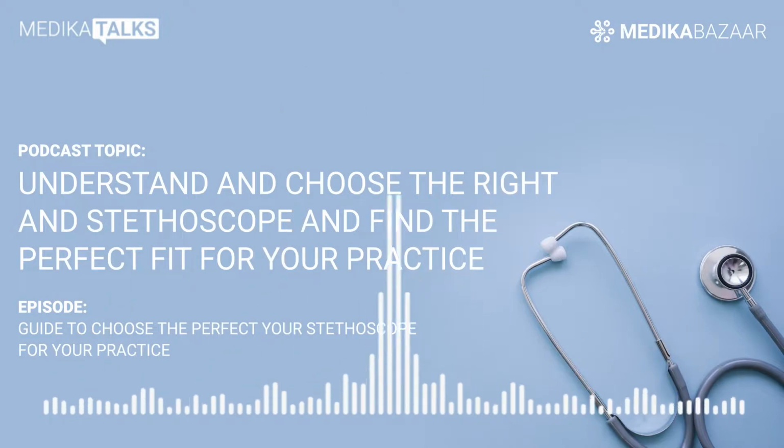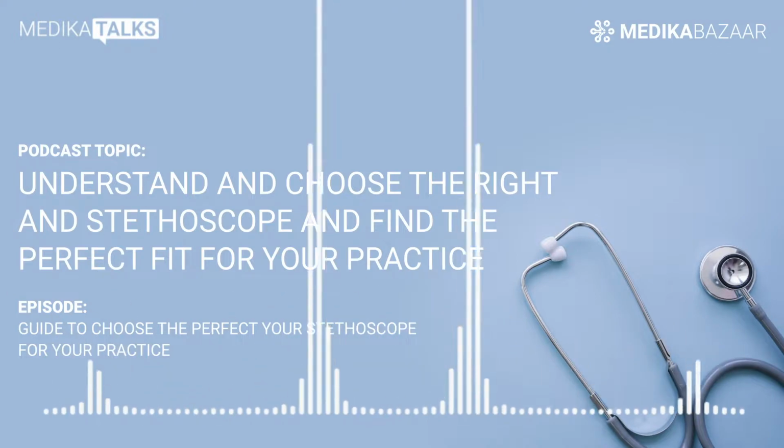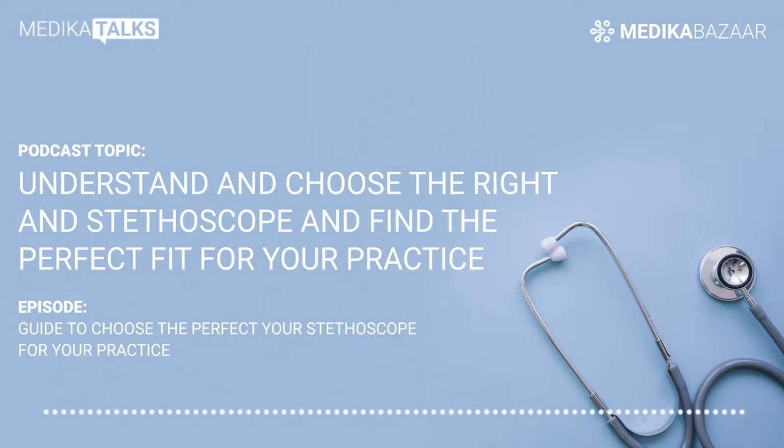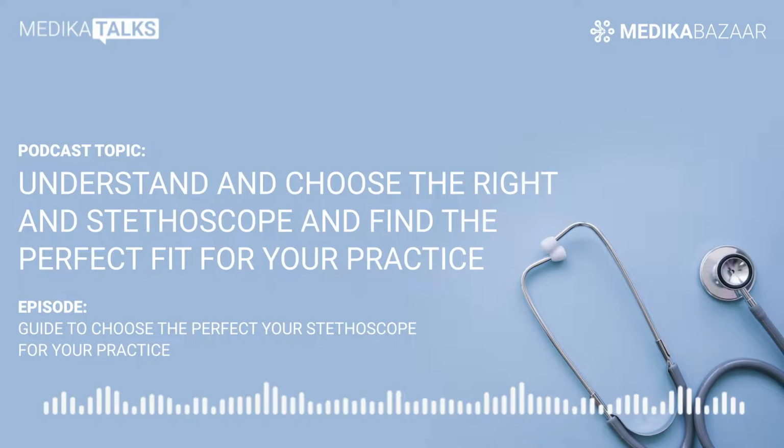The most common length is 27 inches. For some clinicians length doesn't matter, but keep in mind, the shorter the stethoscope, the closer to the patient you are. Tubing quality is another important consideration. The chest piece, the diaphragm and the bell, are two important parts of the chest piece.